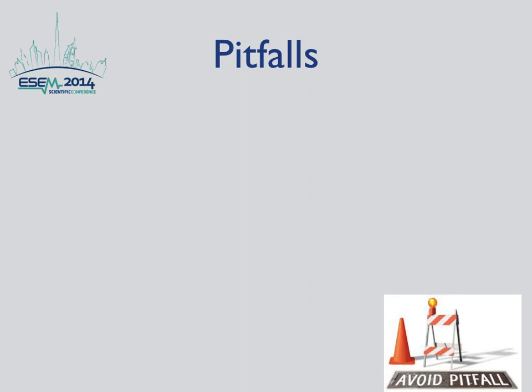It's important to mention some pitfalls for the FAST exam. First of all, over-reliance on ultrasound. Ultrasound cannot evaluate retroperitoneal bleed or distinguish solid organ injuries. Remember when we said the 4 important questions you're trying to answer: is there intraperitoneal hemorrhage or not? We're not looking for specific solid injuries.